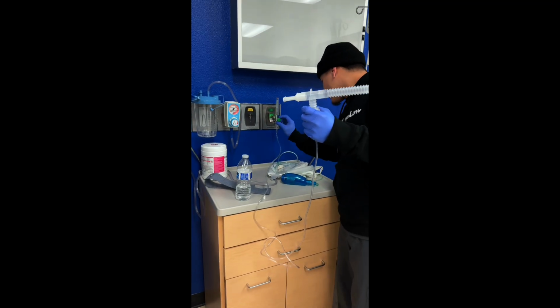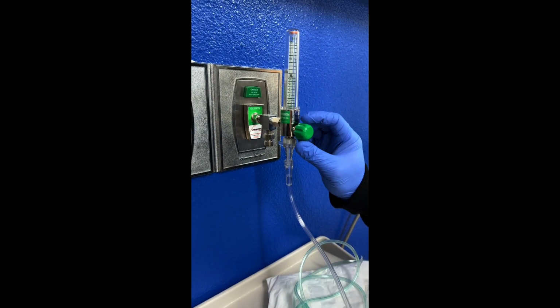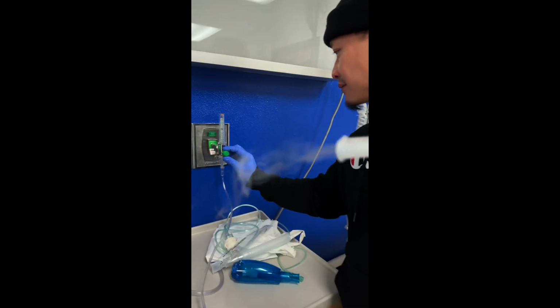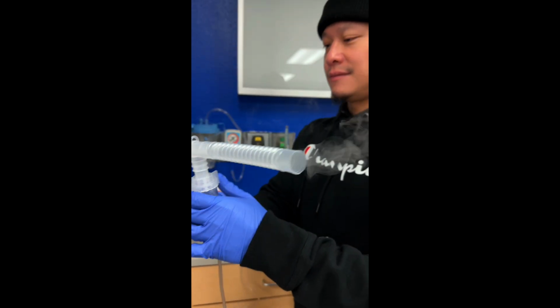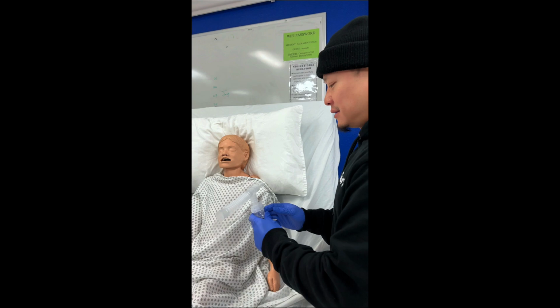I confirm that a visible mist is being produced before placing the mouthpiece on the patient. Once aerosol production is confirmed, the nebulizer is ready for use. Now I'll demonstrate how a small volume nebulizer treatment is administered.